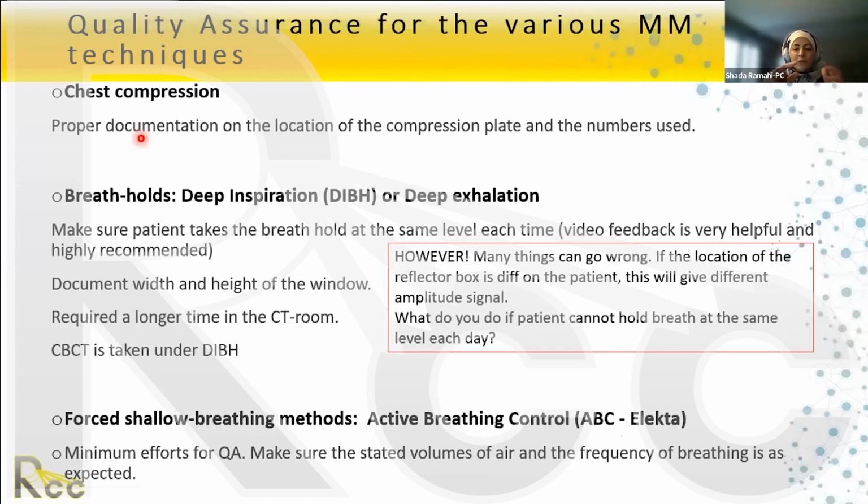No, you have to either delineate it on the patient's skin, by tattoos, by some marks, and you put Tegaderm on them so that they don't remove it. Or you can write something adjacent to the midline and adjacent to the diaphragm, or just touching the xiphoid, whatever you want to write down. But it has to be documented, and that's true for everything else you use, not just for the chest compression.